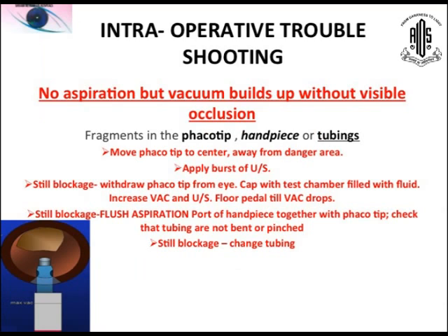No aspiration but vacuum builds up without visible occlusion. There may be fragments in the phaco tip, the handpiece, or in the tubings.